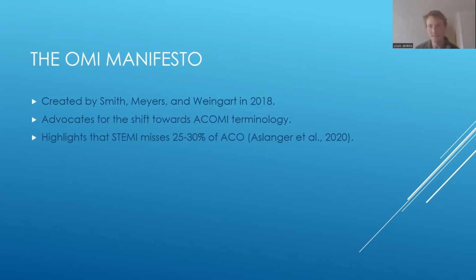So to explain that in a little bit more detail, 28.2% of the patients that were dismissed as NSTEMI, by applying a different set of rules to their ECG, these cardiologists were able to identify findings that were diagnostically equivalent to whether this patient had presented with STEMI, okay? And furthermore, they discovered that this subgroup of reclassified patients had a higher frequency of myocardial damage, and higher frequency of in-hospital and long-term mortality compared to the rest of the NSTEMI group. So this is a really high-risk group of patients that we're looking at.